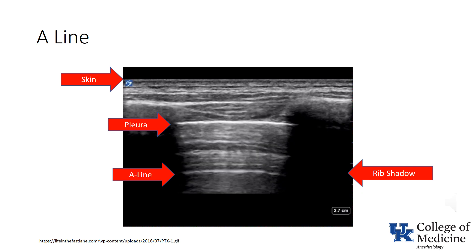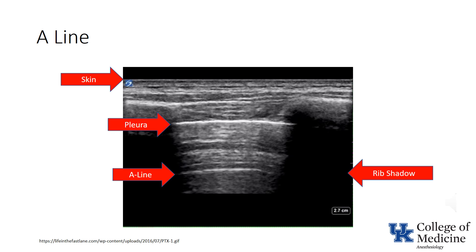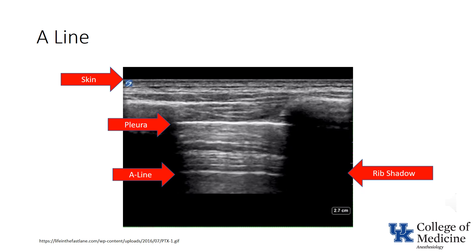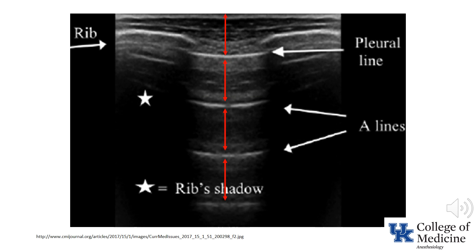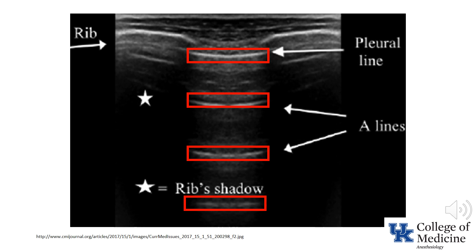This ultrasound demonstrates an A-line. As previously described, it is a reverberation artifact of the pleura, which appears as a horizontal line at a depth that is a multiple of the distance between the skin and the actual pleura. There are several characteristics of A-lines: first, they are identical in shape to the pleural line; second, they occur at regular intervals deep to the pleural line; and finally, the brightness is diminished with each replication.